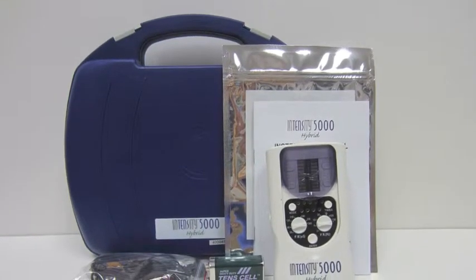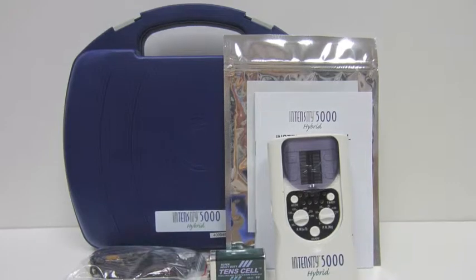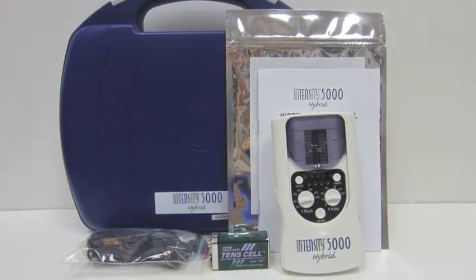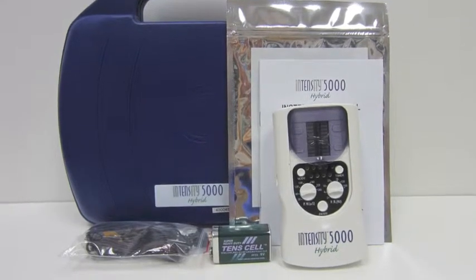Inside we're going to find the instruction manual, electrodes, the Intensity unit, the battery, and lead wires.